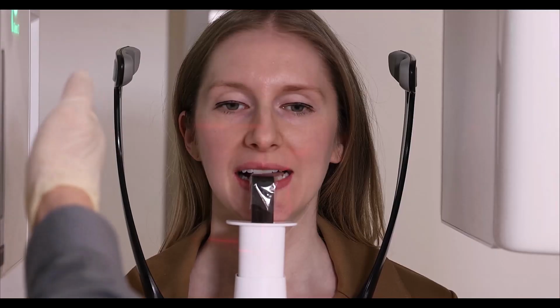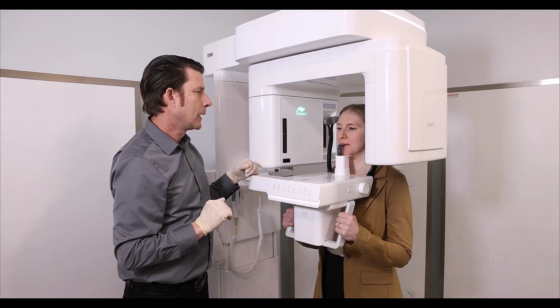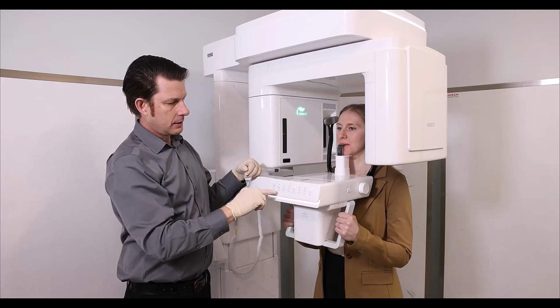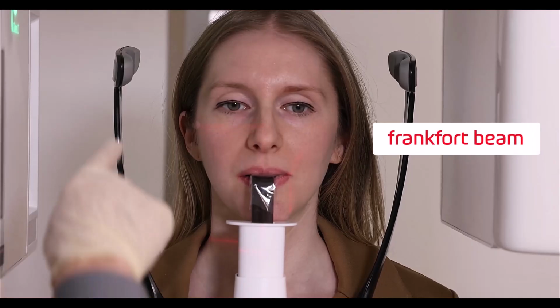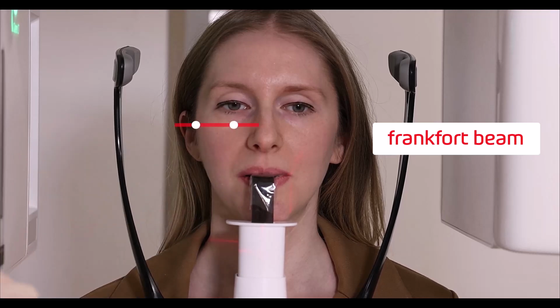We also have, projecting from our overhead here, a Frankfurt horizontal beam. We're going to run that from the top of the tragus to the infraorbital notch, and that's going to be on the front here. You have your beam up or down. You can see as I move this, I'm going to put this to the top of the tragus, and it is projecting through the infraorbital notch of the eye.